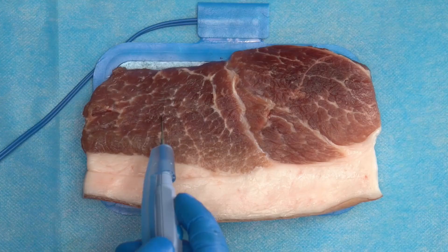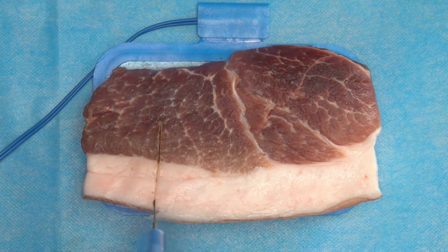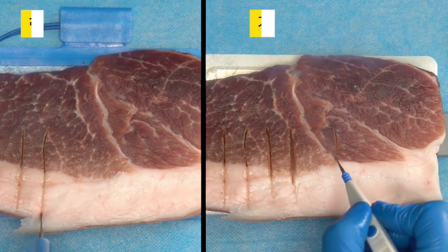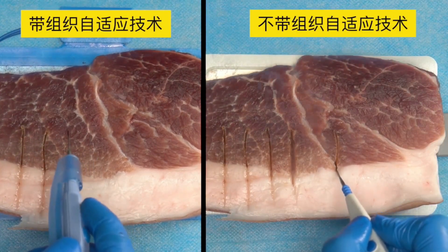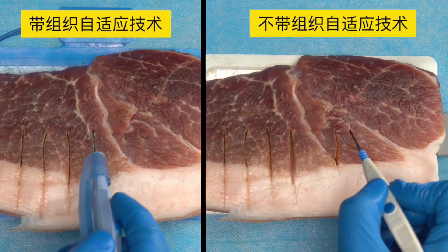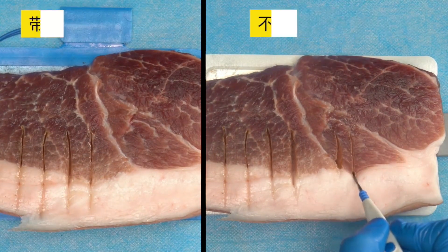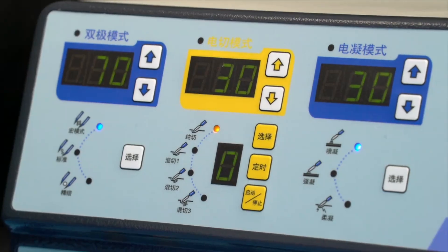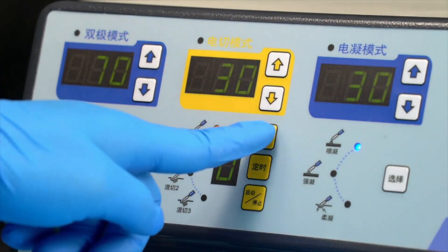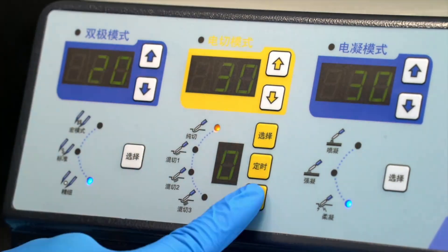The S300D electrosurgical unit adopts a new generation of tissue power automatic compensation technology, which senses the density difference of different tissues through closed-loop feedback, makes cutting smoother, and can greatly reduce tissue thermal damage. Through the start button on the front panel, we can easily realize the EndoCut endoscopic cutting function and set the electric cutting or coagulation frequency.